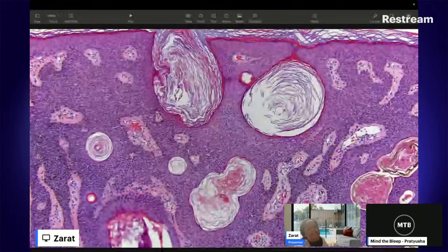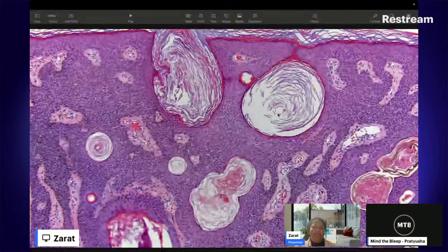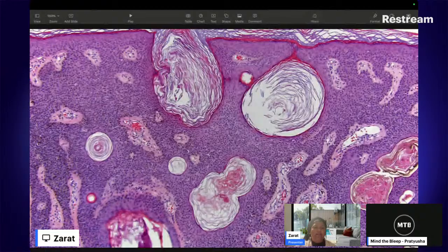Now, if we try to use the criteria we have learned, that the malignant cells tend to be more ugly, with larger nuclei, we can't really see any of those features here. They all look uniform, small, not a lot of mitosis. So at this point, I'd probably say, okay, we're leaning towards benign.